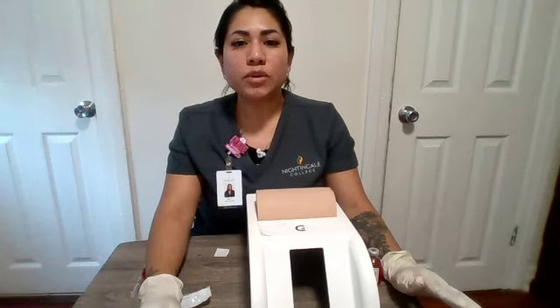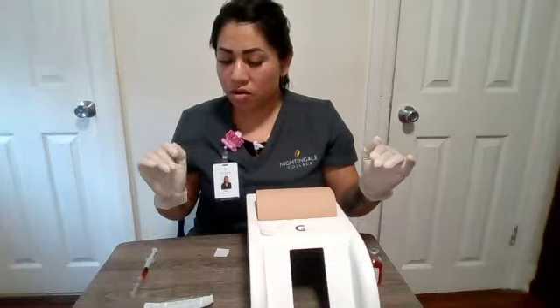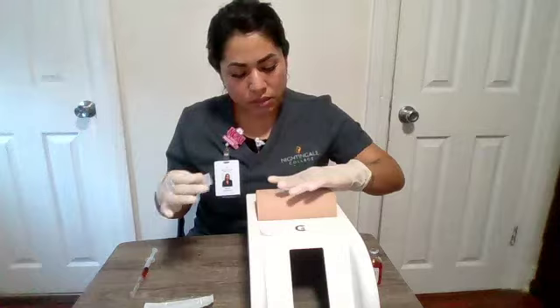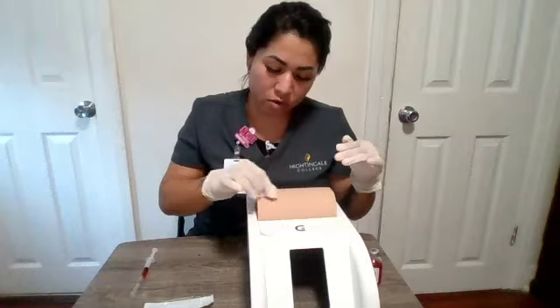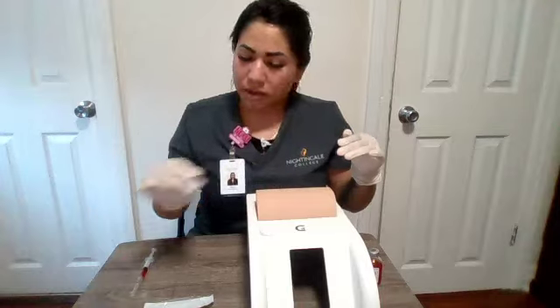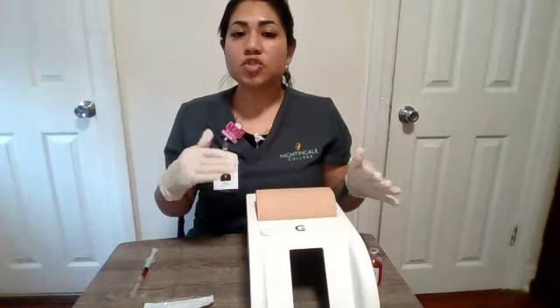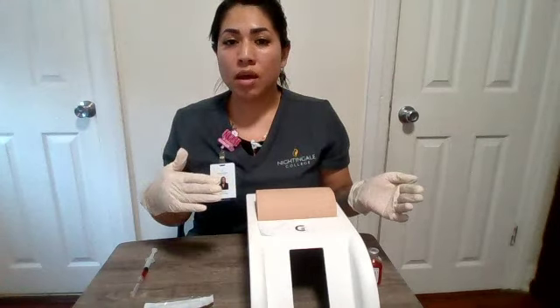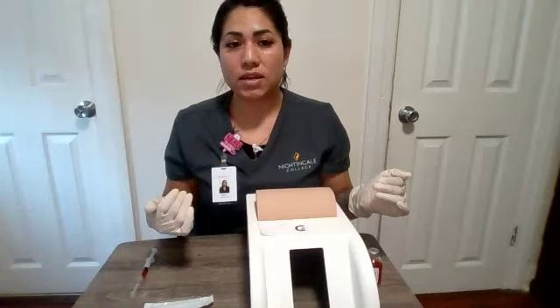Okay, so now first we're going to start by cleaning my patient's site with an alcohol pad. So right over here is our site. I will clean it in a circular motion, going 2 inches out. Then I will make sure that this dries completely, and we do not want to blow on it or hand dry by waving our hand over it. And we also do not want to touch the site once we have cleaned it.